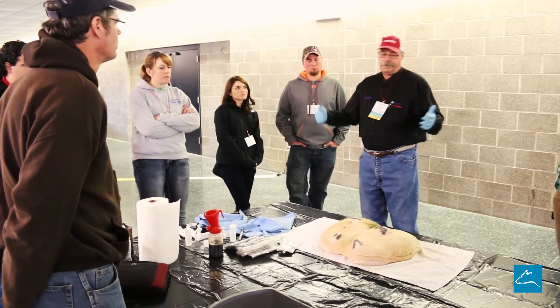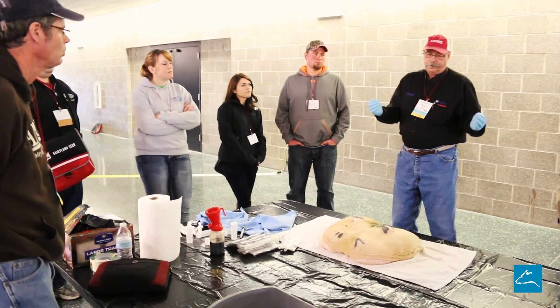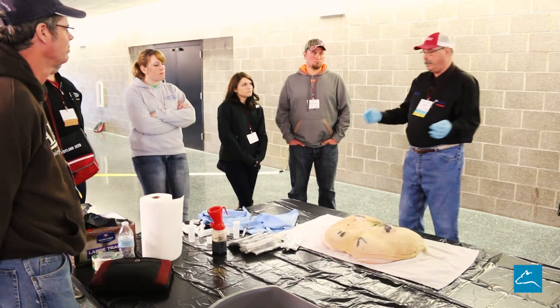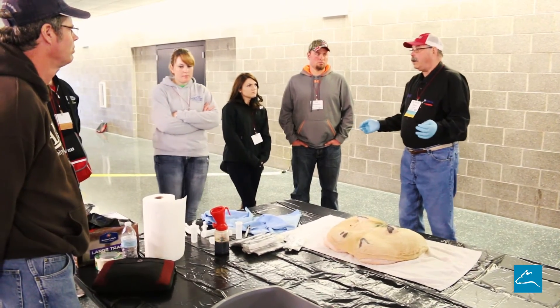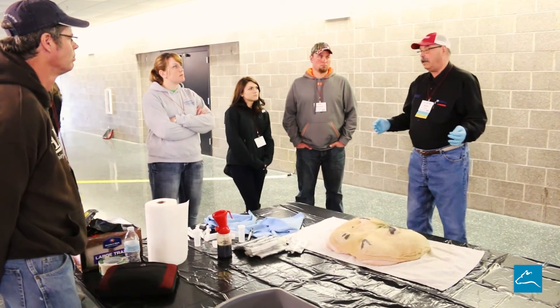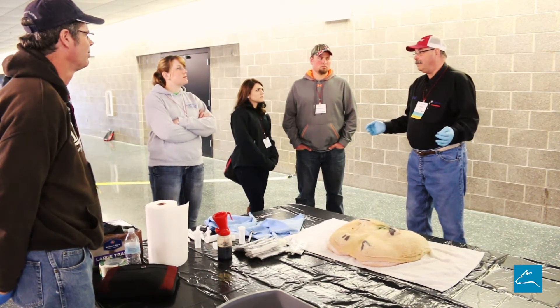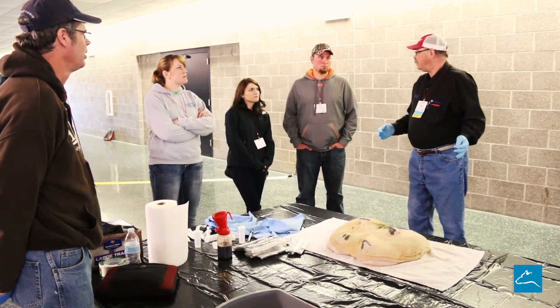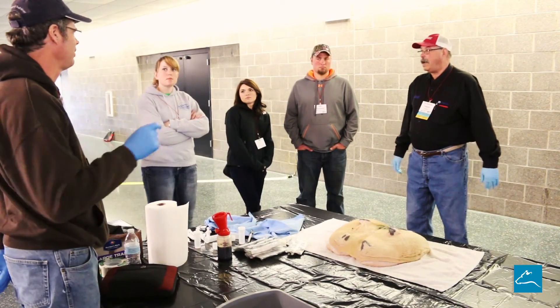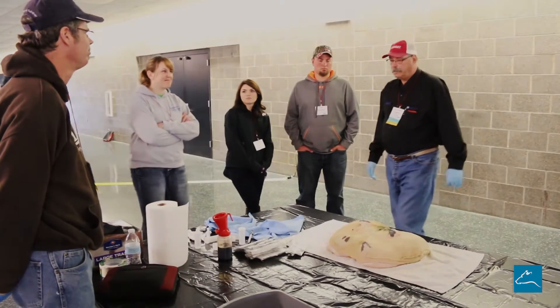In a stanchion setup, that's actually the best way to do it — prep them. There is some debate about whether to take the culture before or after milking. We really don't care either way. I have some veterinarians that say they're a lot cleaner at the end of milking. But even if you take it after she milks, still scrub with the alcohol, because even after she milks you will still get dirt off the teat end — you wouldn't think so, but you will.